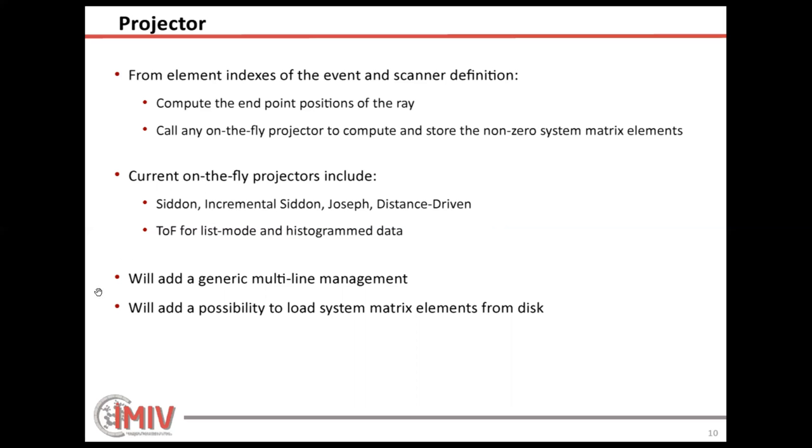In the near future, we will also add a generic multi-line management so that if you want, for example, to compute a projection with a Monte Carlo estimation of the solid angle, you can use multiple lines to do that. Because for the moment, we provide this, but it is specific to the incremental Siddon projector. So we just want to put this implementation one level up so that it can be used with any type of projector. And we will also add the possibility to load system matrix elements if they were already pre-computed.